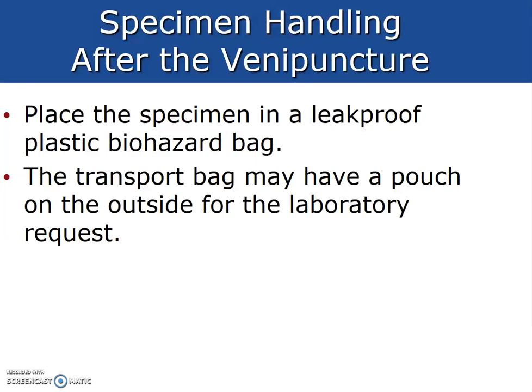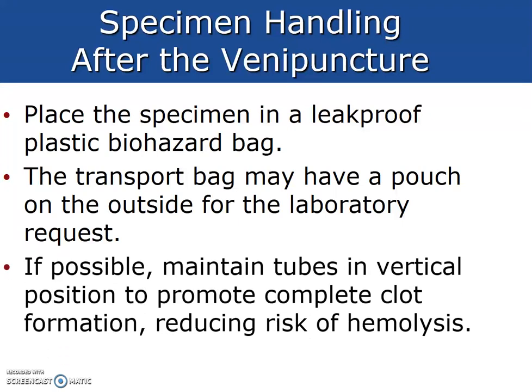Place the specimen in a leak-proof plastic biohazard bag. The transportation bag may have a pouch on the outside for laboratory requests. Please place that in the designated spot, because if possible, if we were to put the requisition inside with the specimen and there was leakage, now the requisition's ruined as well.